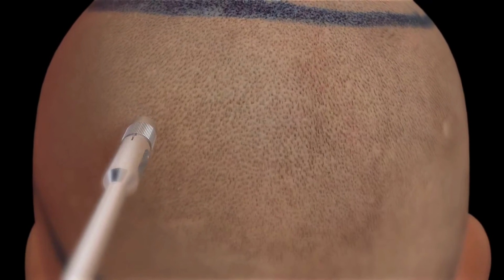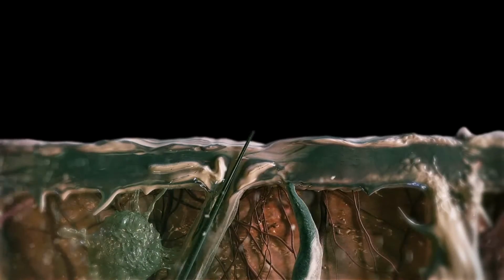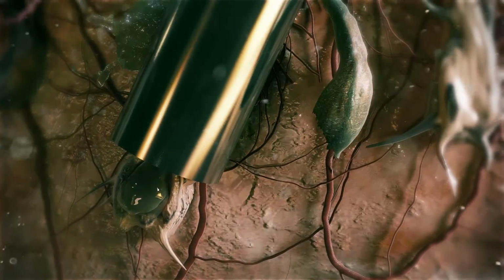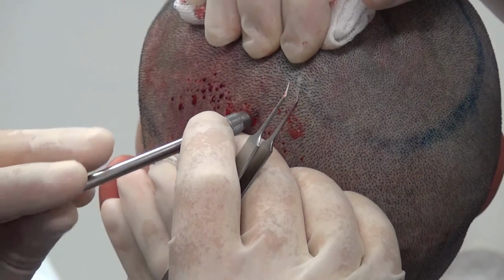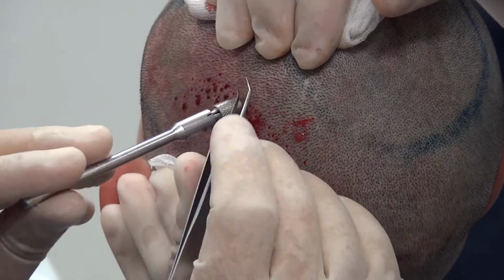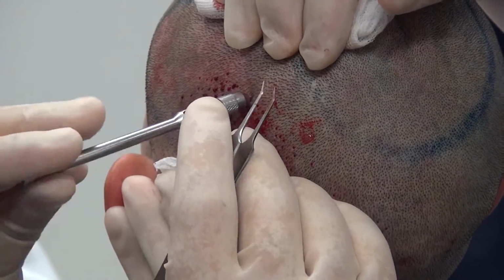After passing through the epidermis, the position of the punch is adjusted according to the follicle direction. The dominant forceps hand, one graft at a time in rapid sequence, accomplishes sequential harvesting. This is to provide an opportunity to control the transection and graft quality each time. Also adapt the punch size or angle to the changing diameters and directions.